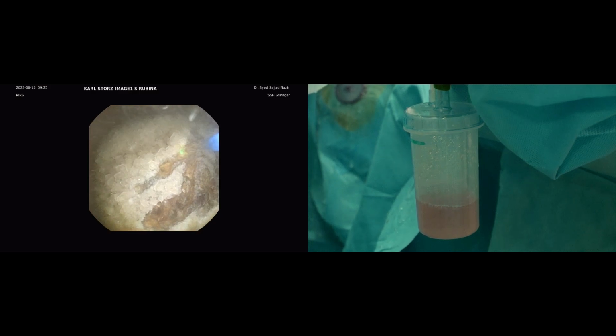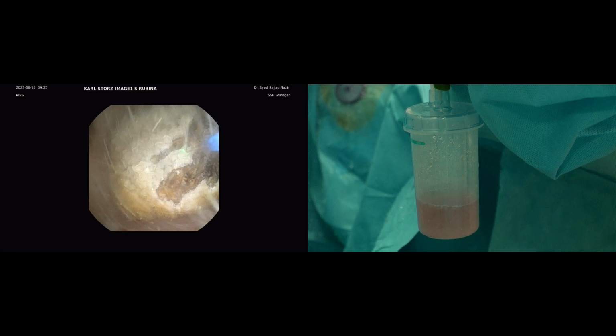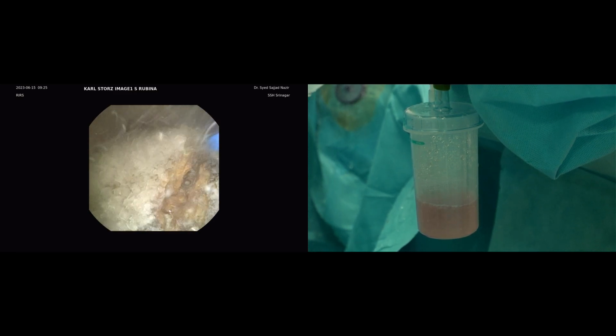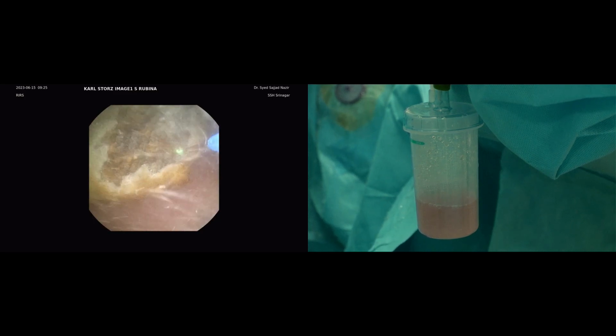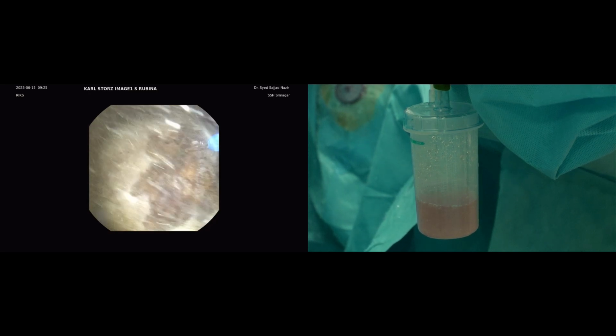You have to be very careful, for the youngsters or the beginners doing this, about the movements, the respiratory movements of the patient. You have to be very careful with inspiration and expiration. You also have to hold your own breath, like inspiration and expiration.